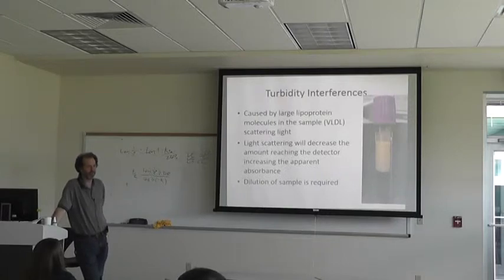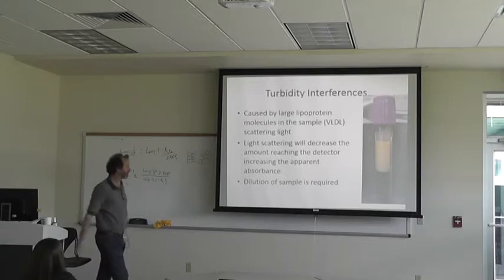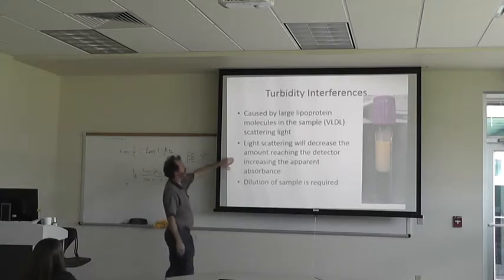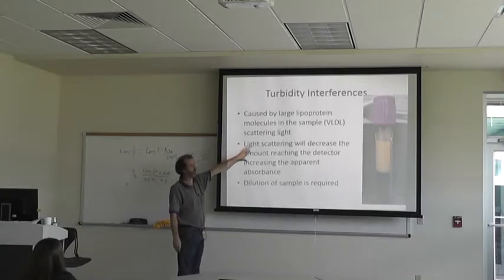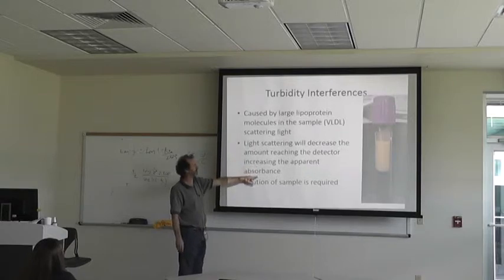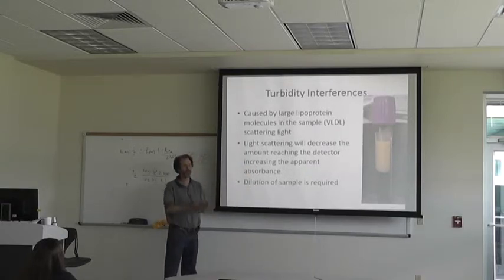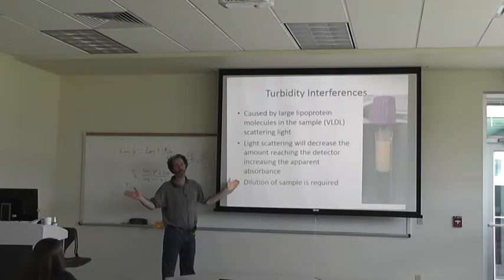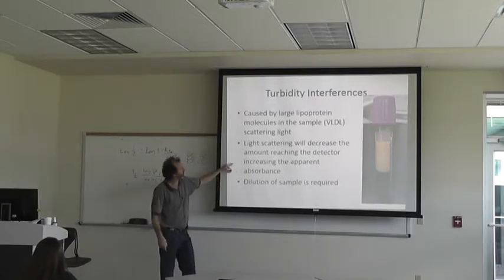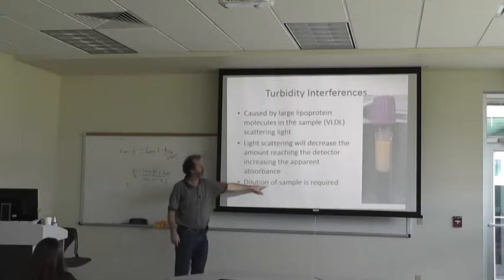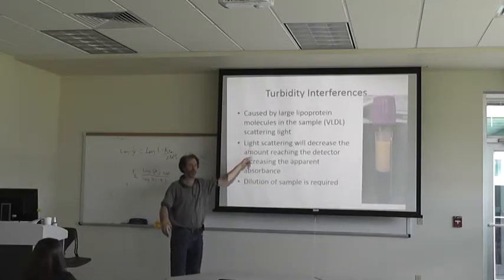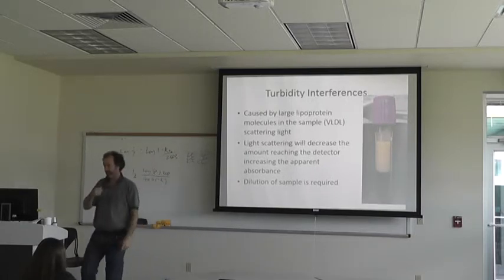This is going to cause a lot of light scattering, which is going to decrease the amount reaching the detector, or increase the apparent absorbance, or increase the apparent fluorescence too, because it's scattering the light shining on it and scattering to the side. What you want to do with samples like this is dilute them down to where the scatter either goes away or is not significant.